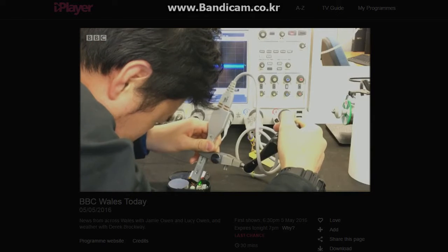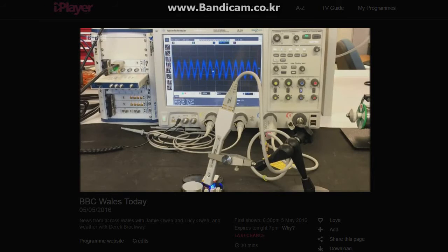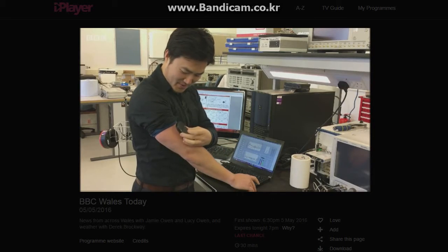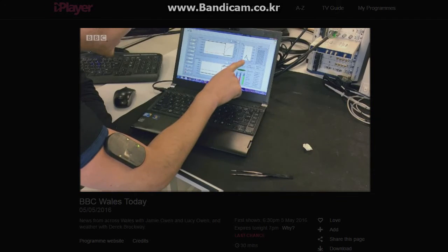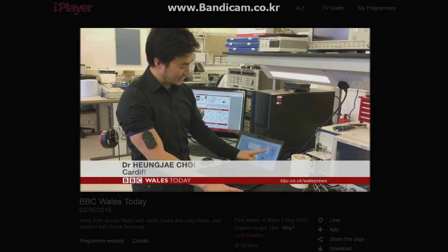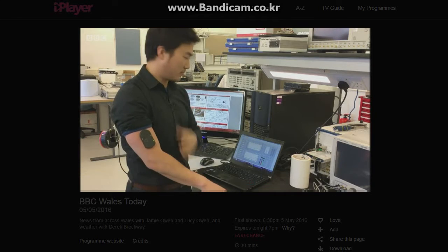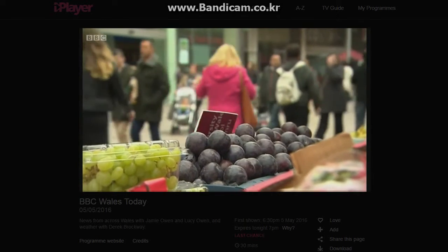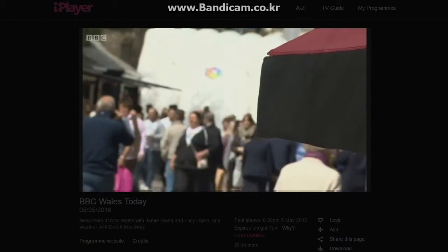Scientists at Cardiff University have developed a new device which measures glucose levels using microwave technology. Stick it to your body. Every time there's a change of glucose level, that resonant signal tracks the change of property in your blood.